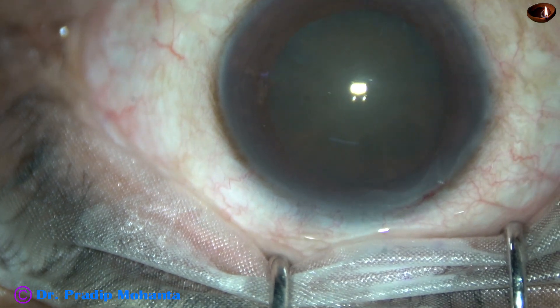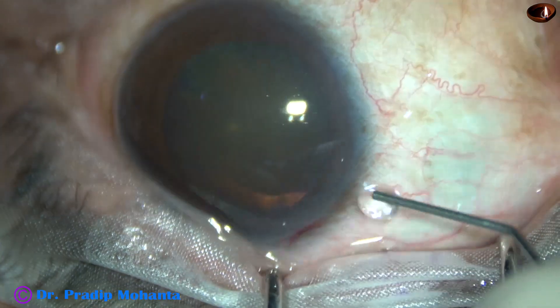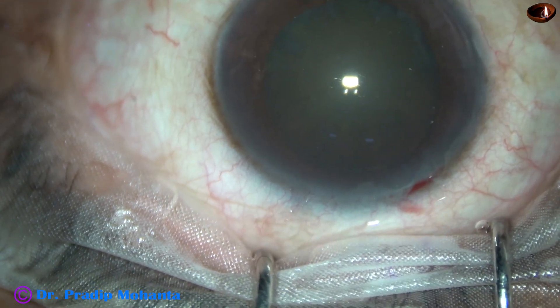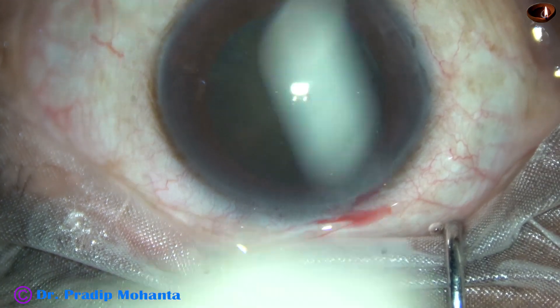Now, after the main incision, I am using phenocaine. This is a combination of lignocaine, tropicamide, and phenylephrine. This is a product of Intode Pharmaceutical India.